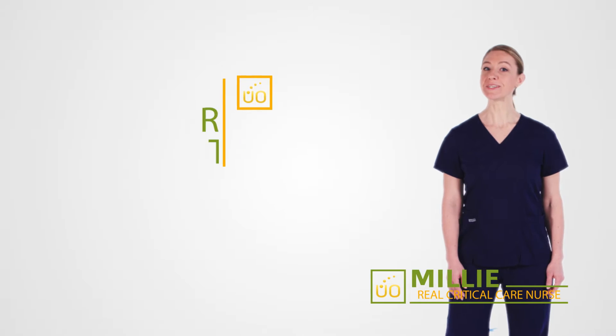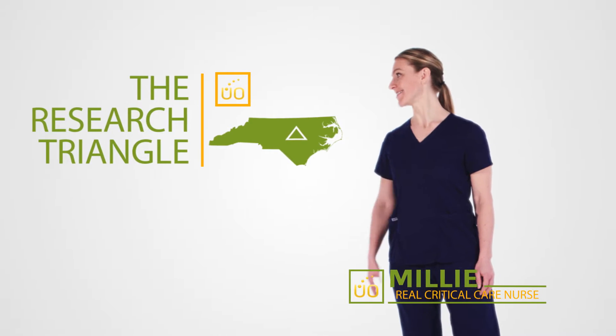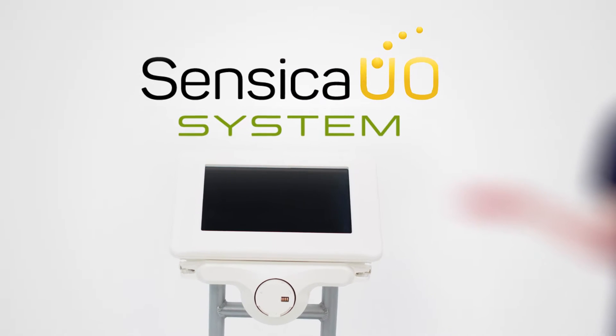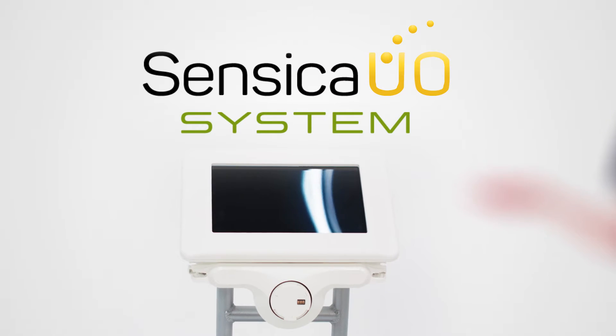Hi, I'm Millie. I'm a nurse in the Research Triangle area of North Carolina, and this is the highly accurate, user-friendly Sensica UO system, used for close monitoring of urine output.